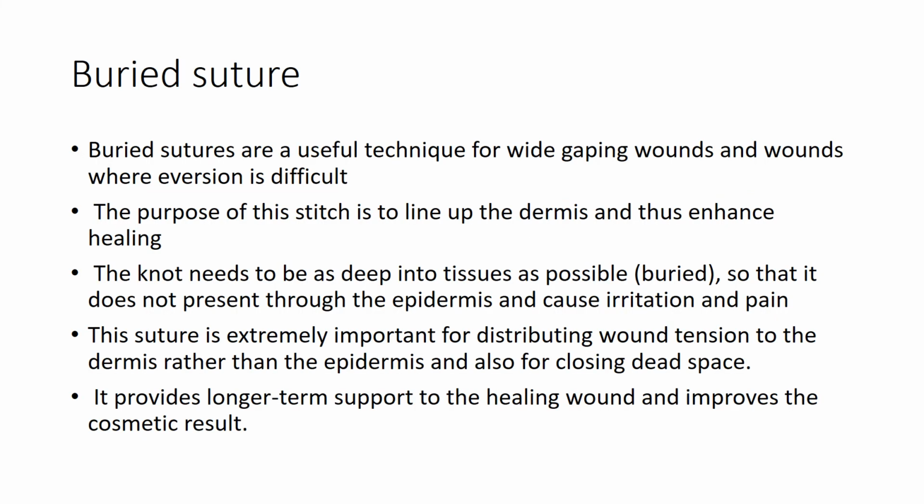Finally is the buried suture. Buried sutures are a useful technique for wide gapping wounds and wounds where eversion is difficult. The purpose of this stitch is to line up the dermis and thus enhance healing. The knot needs to be as deep into the tissue as possible, meaning it is buried, so that it does not present through the epidermis and cause irritation and pain.